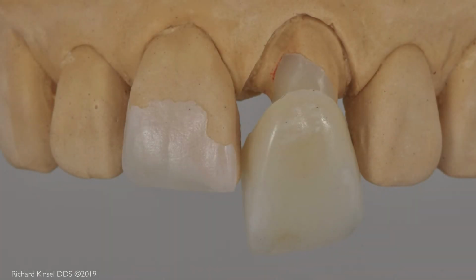The porcelain crown is supported by an all-ceramic post. This allows a transmission of light as found in natural teeth. The partial porcelain veneer has a wavy edge that masks the junction between the porcelain and the tooth enamel.